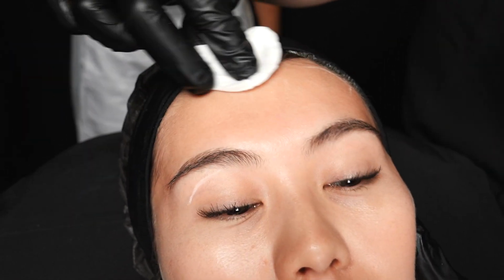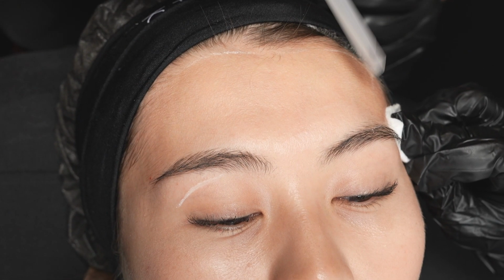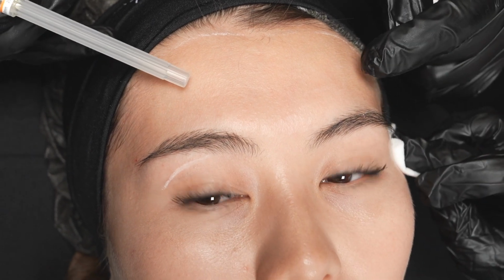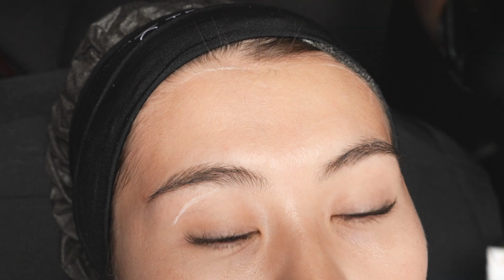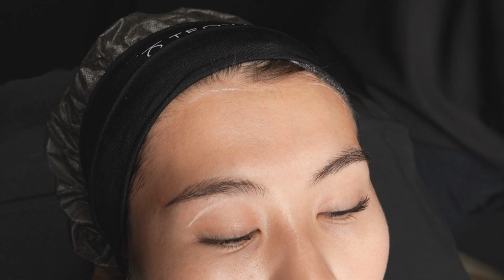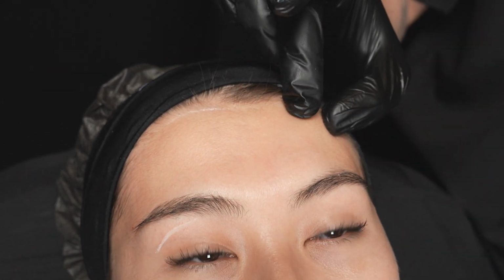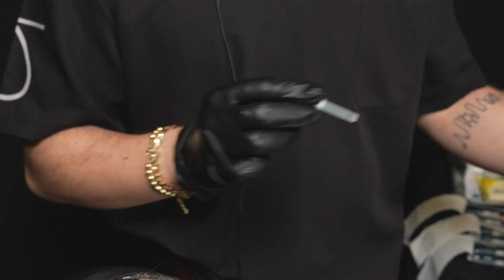Теперь давайте продолжим работу непосредственно с лобной частью. Я могу выбрать еще одну точку, либо непосредственно начать с 2 точек. Я могу оттуда латерально работать, либо из одной точки я могу использовать веерную технику. Давайте я попробую воспользоваться одной точкой. И опять-таки у меня план такой. Этой пациентке не нужно слишком много объема. Именно поэтому я могу выбрать волюмайзер вроде RHA 4 или RHA 3. Давайте поработаем над RHA 3, это шприц с красной насадкой. Давайте поработаем из одной точки.